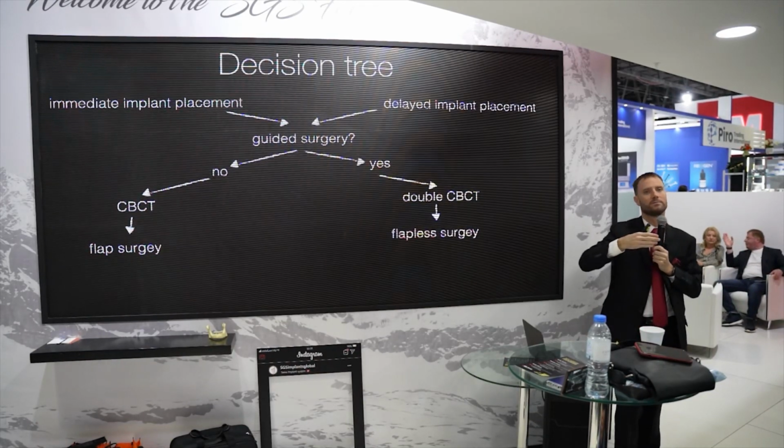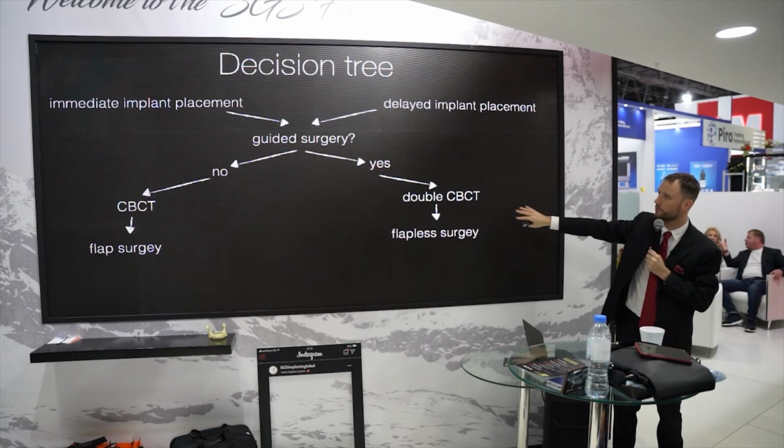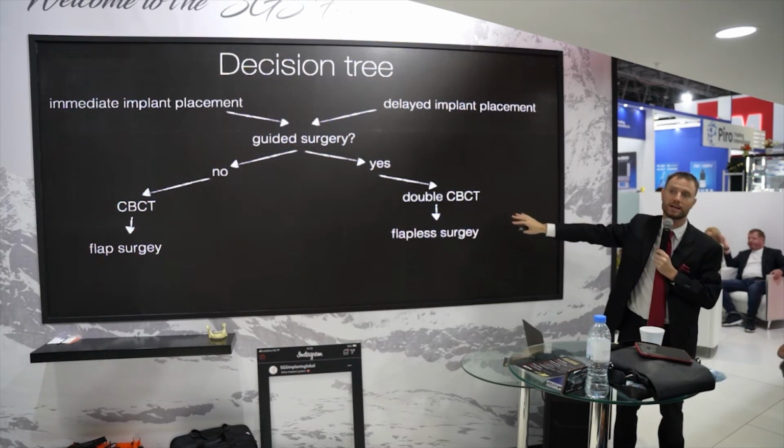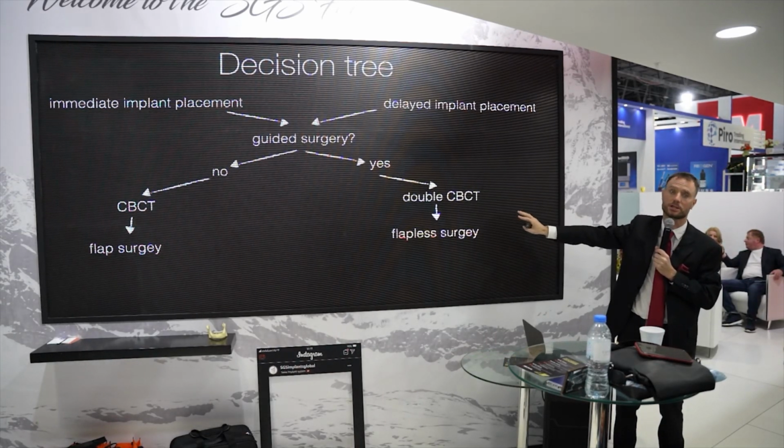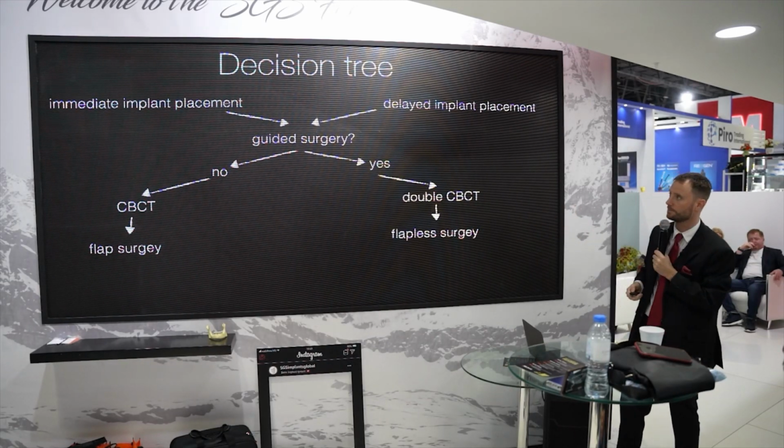For the normal freehand surgery, we usually use the flap surgery. To be honest, for the guided surgery, you can use a flapless surgery, but I myself still prefer the flap surgery because of the soft tissue management. Minimally invasive flap, but I think it's better for the soft tissue.